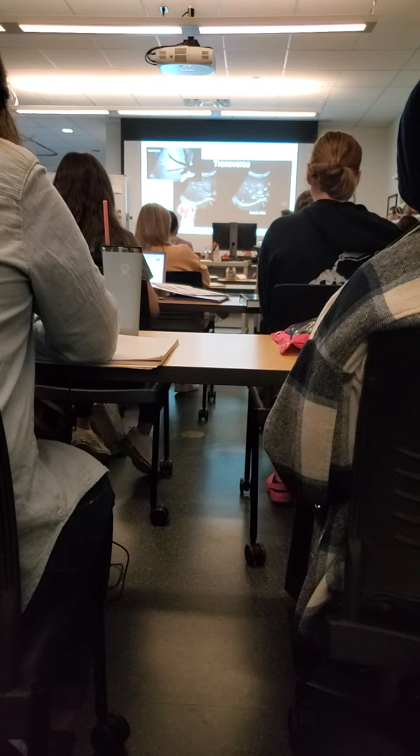Here is what they look like on ultrasound. They're so cute. It looks kind of like a reindeer, a deer. You'll get the Playboy bunny a lot. That's kind of what we nickname all of them. And you're not always going to get all 3 on some people. You may only end up getting 1 or 2. If you get all 3, you've got a really good scan.